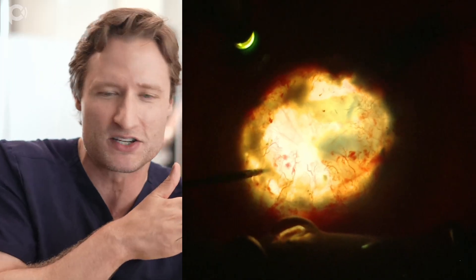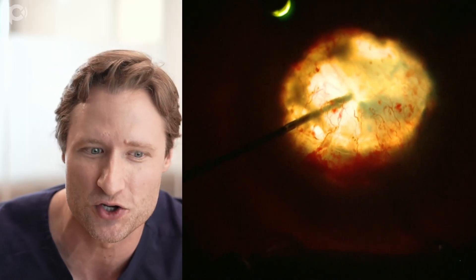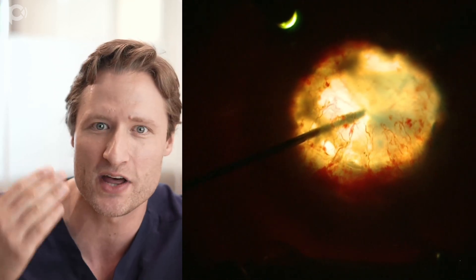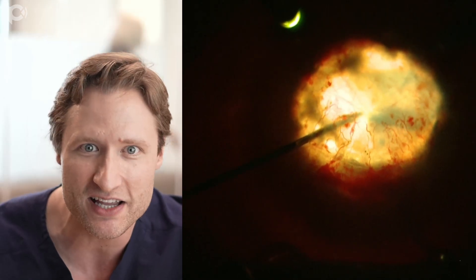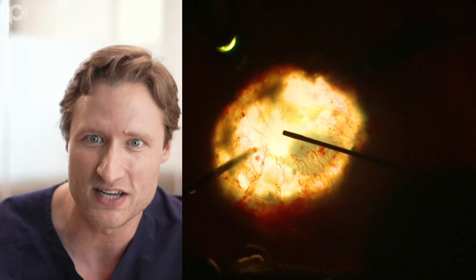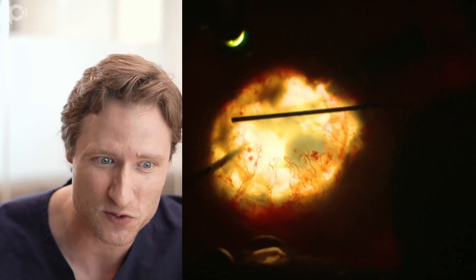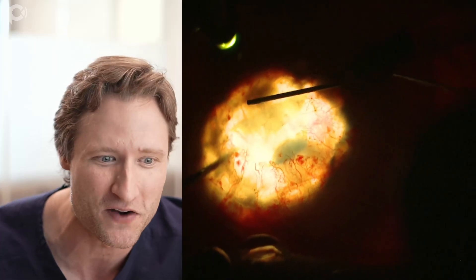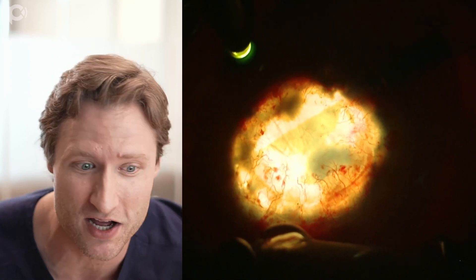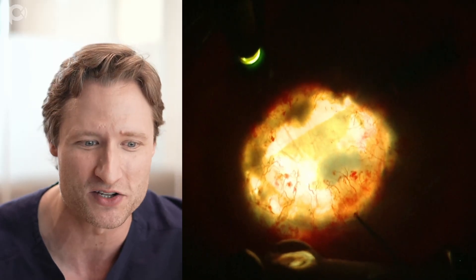The graft has been pulled maximally to this side already, so I'm going in from the other side using the same 25-gauge coaxial forceps, grabbing the edge of the graft and pulling it this way while placing taps on the corneal surface. Finagling coaxial forceps through a paracentesis can be difficult - that's why I like large paracenteses. The graft looks pretty well centered now - 70% unfolded. There's just this last lingering inferior edge fold that if we could iron out, the operation would be done.